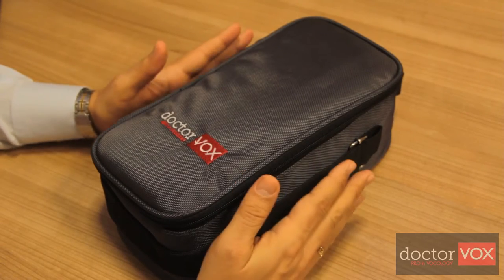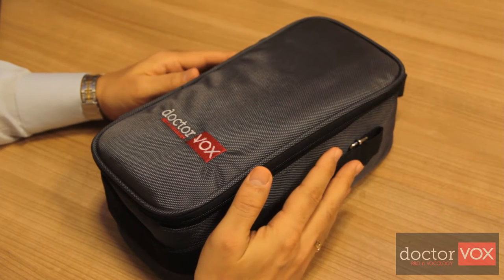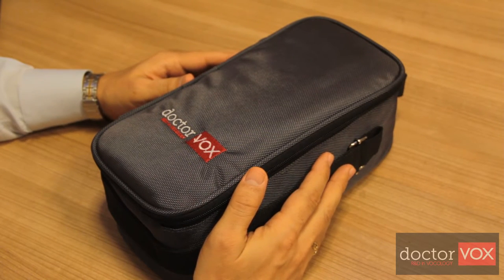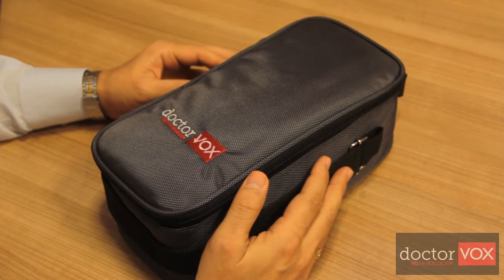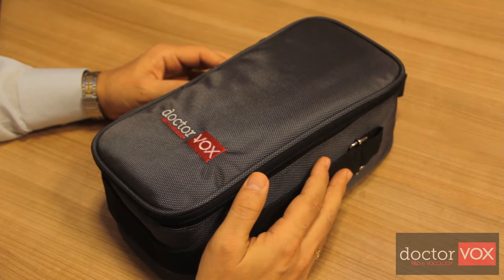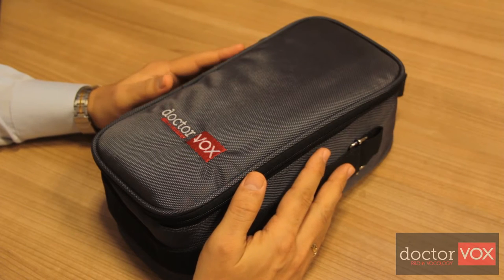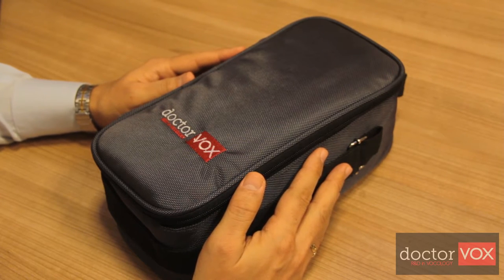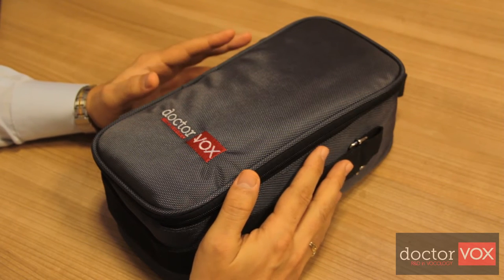This is Dr.Vox's set. Dr.Vox is designed for the voice patient and the professional voice user in order to rehabilitate and habilitate human voice. The device is based on Lexvox's voice therapy technique, and two main mechanisms are included in this technique.